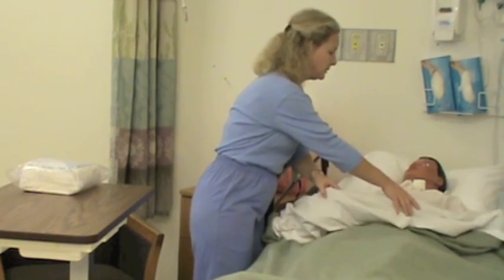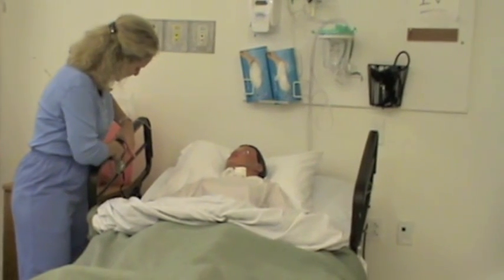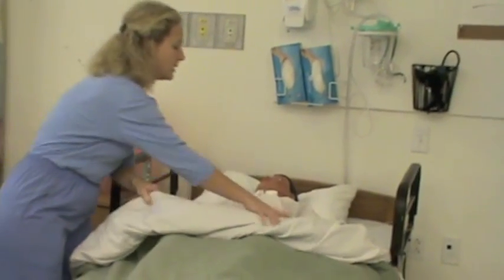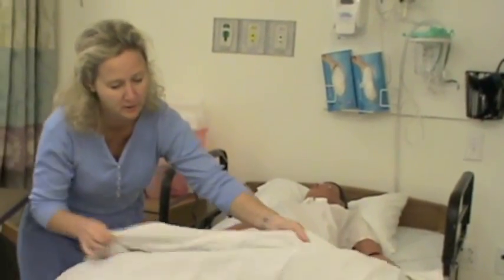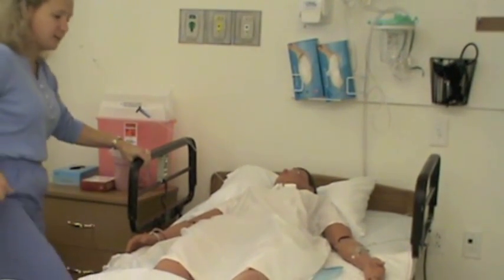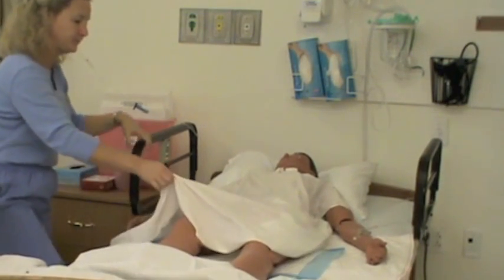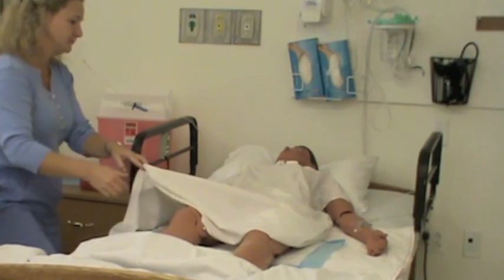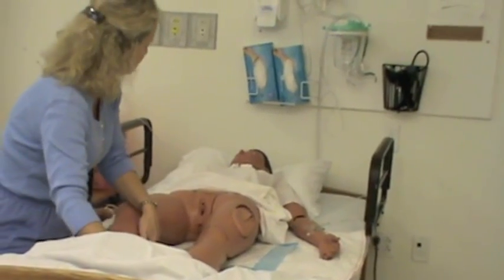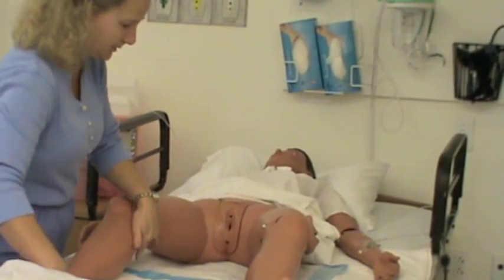I'm going to lower your blankets and help you get into a position that's comfortable for the insertion so I can visualize. Put your head down. We've got the door closed and we have some privacy. I'm going to raise the bed up. And I'm going to have you just bend your knees up and then just let them kind of gently fall out. I'll help you with that. Wash your hands.